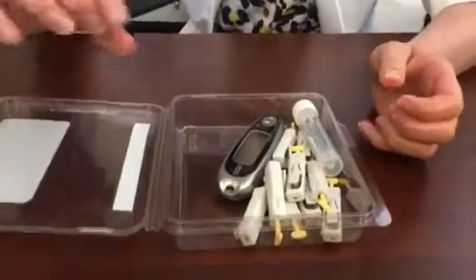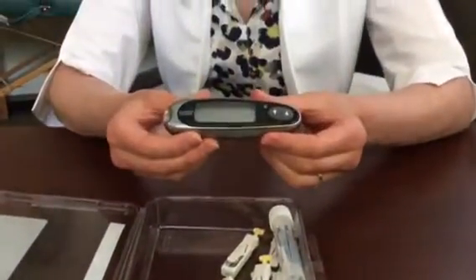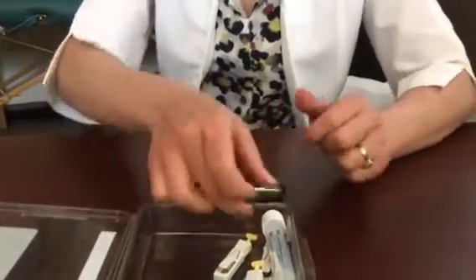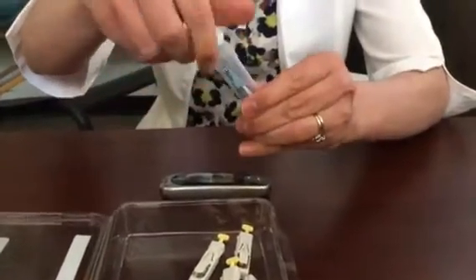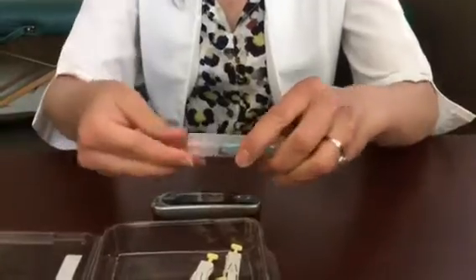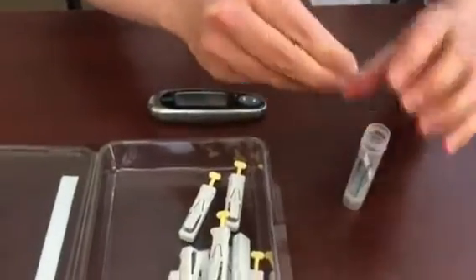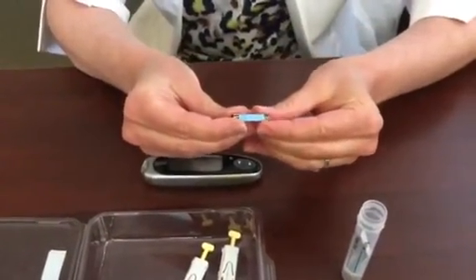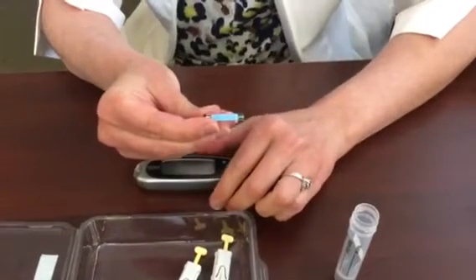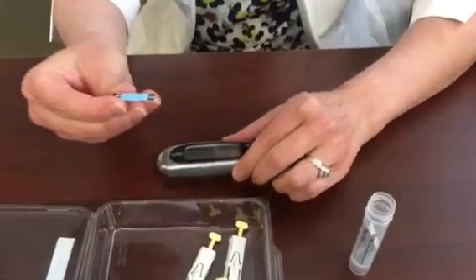The first step is to remove the glucometer machine from the case and to insert a test strip. The test strips are inside this vial and you will have a limited amount, so it is important that you try to do the test correctly because you need to take several samples. We're going to insert the strip with the blue colored side facing up and with the white and black strip side entering the machine first.